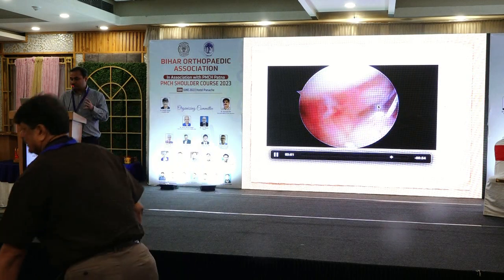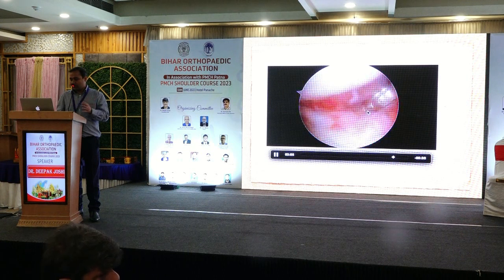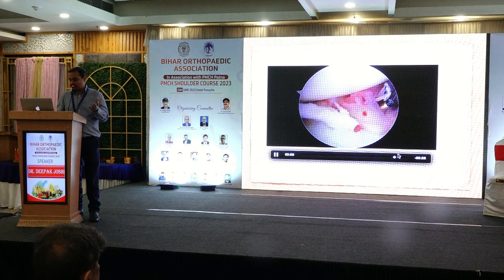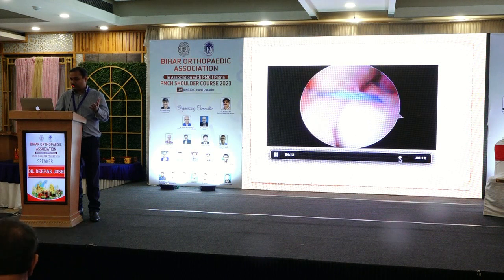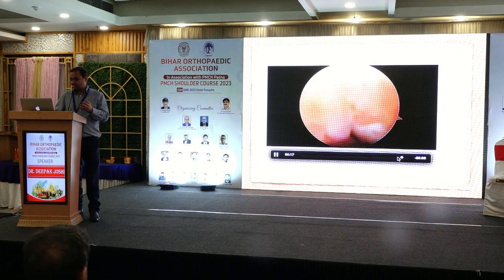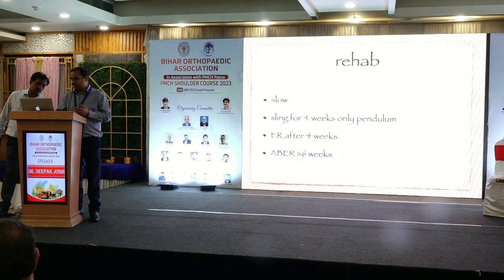So at the level of subscap, this is subscap, 3 o'clock position. So the 3 anchors, the Bankart is fixed, and then we fix the remplissage. So now we are tying the remplissage. We are going posteriorly. You can see how it looks. We go posteriorly. This is how we tie it.